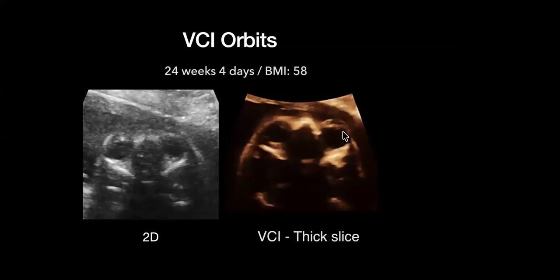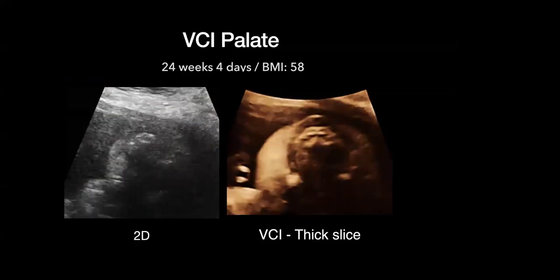And here you could see how that has improved dramatically. Also, when looking at the palate, here you could see with 2D imaging, I cannot see the alveolar ridge. It's hard for me to actually appreciate the back of the palate, which could be tough, and see how tough the imaging is. But when you turn on VCI thick slice, you could actually appreciate the alveolar ridge here. And there is actually the lip to see the palate.